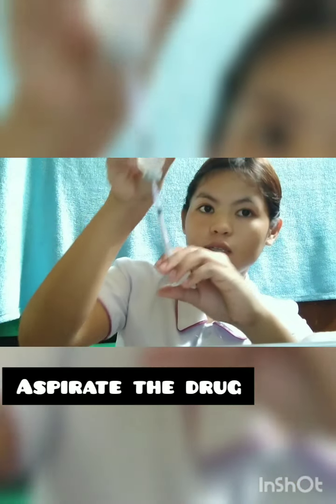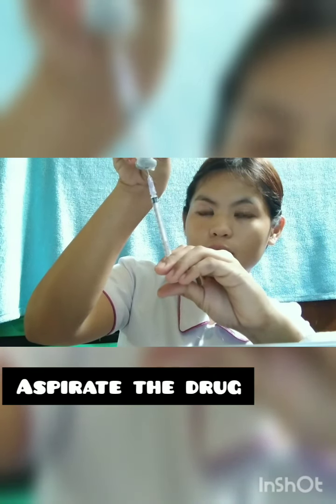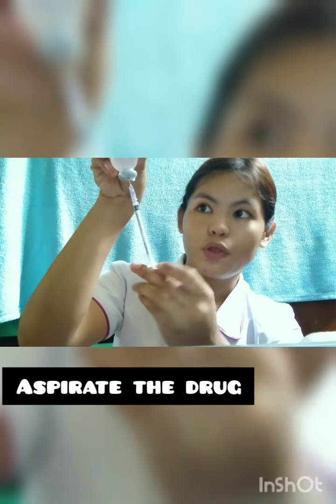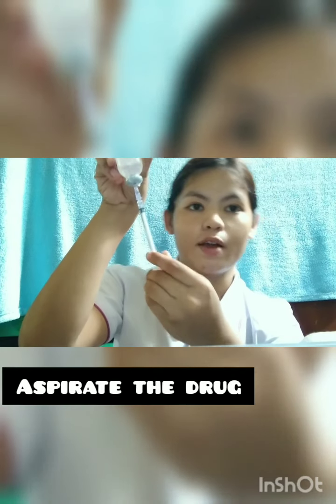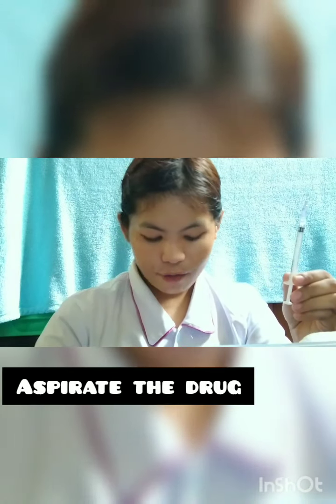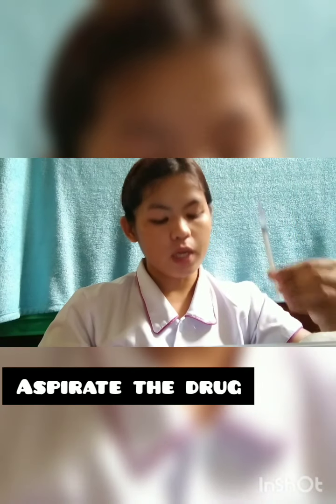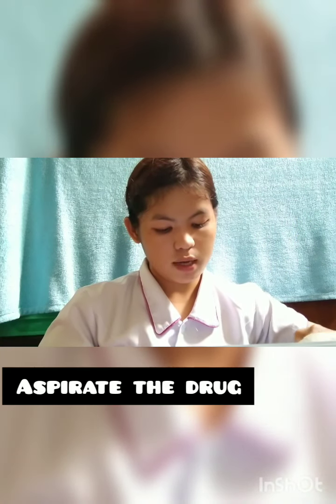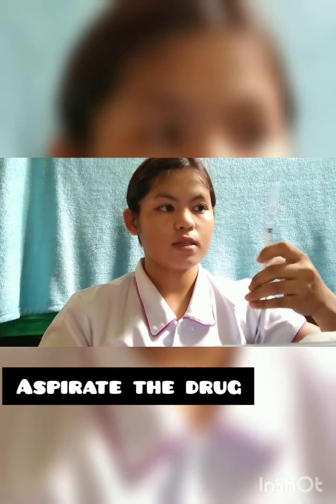I'm going to let the air in like that before I withdraw. There. And after that, I will cap the needle again using the fish hook technique to prevent needle stick injury, like this. After that, I will remove this aspirating needle.